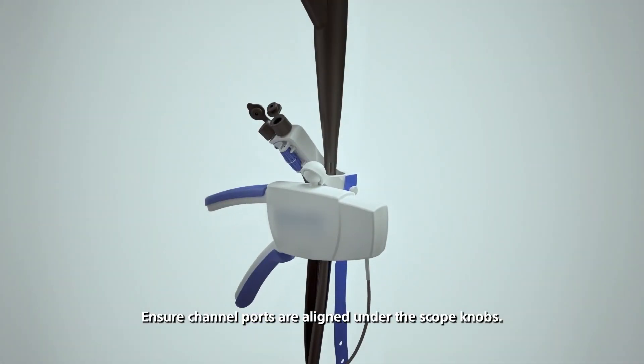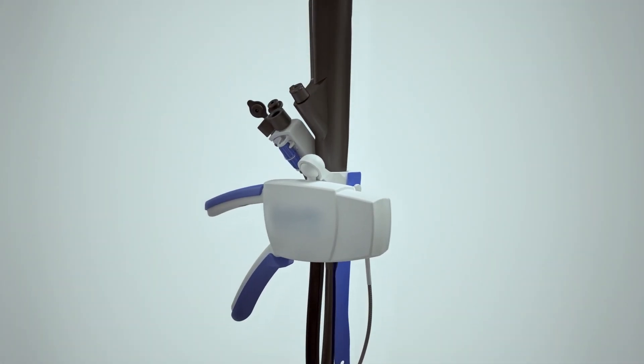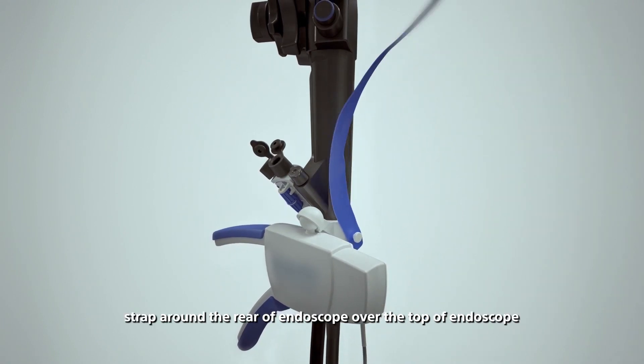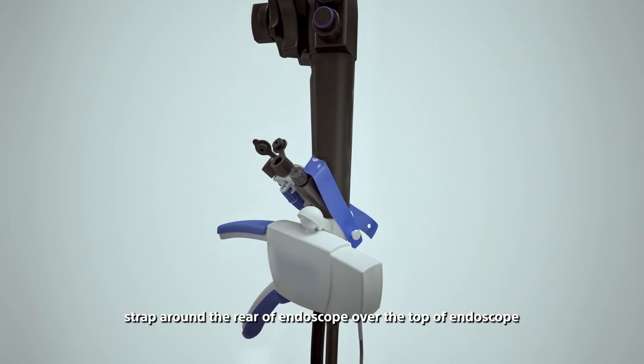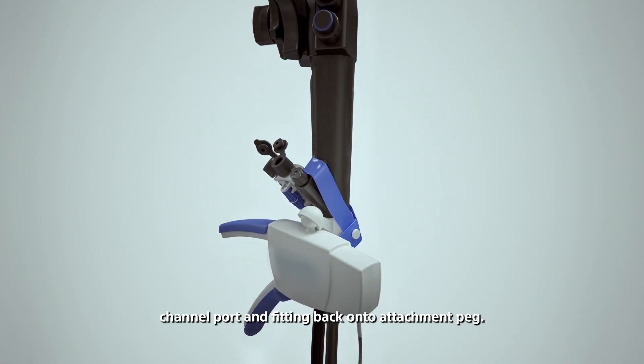Ensure channel ports are aligned under the scope knobs. Secure by stretching the blue rubber handle strap around the rear of endoscope, over the top of endoscope channel port, and fitting back onto attachment peg. Close the handle.